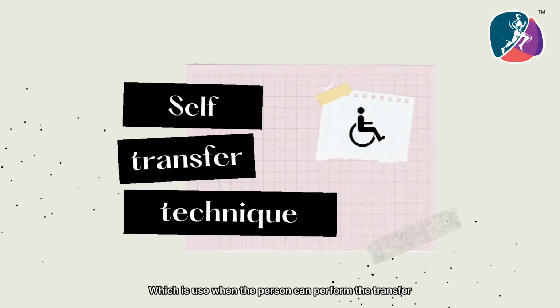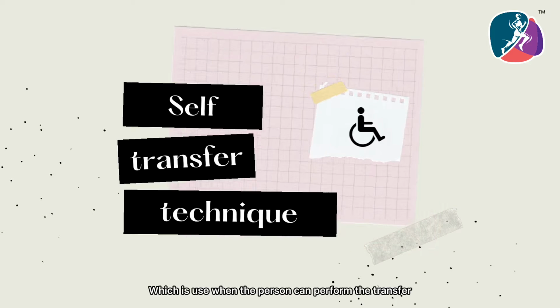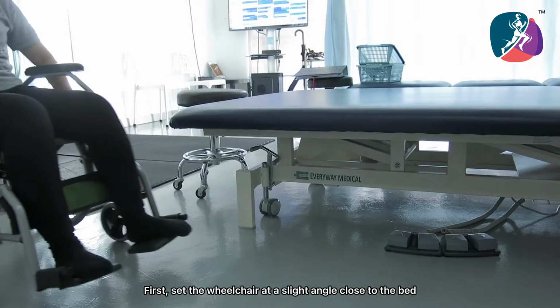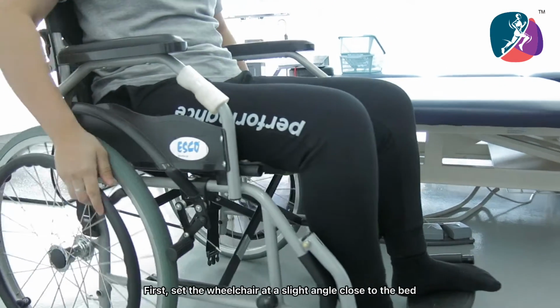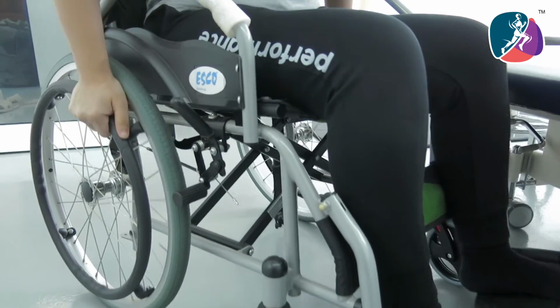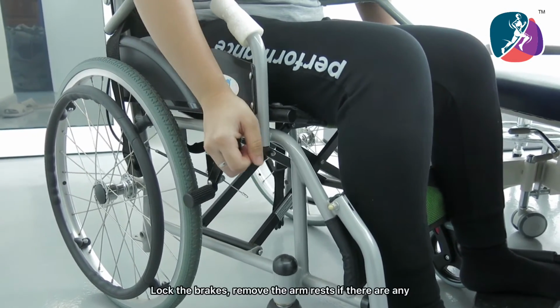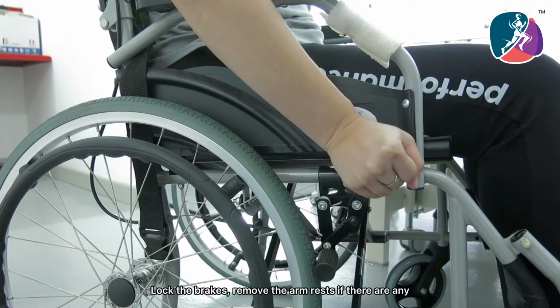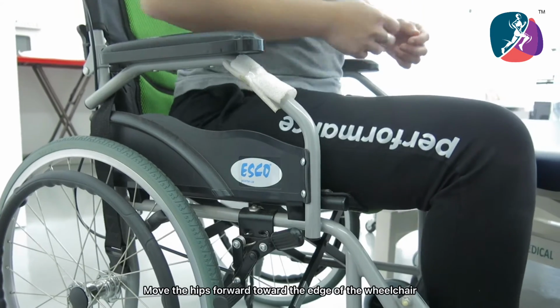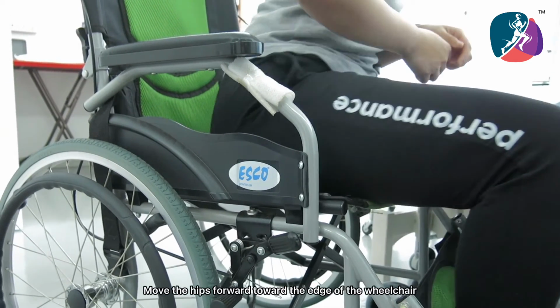Self-transfer technique, which is used when the person can perform the transfer safely without any assistance. Pop-over transfer. First, set the wheelchair at a slight angle close to the bed. Lock the brake. Remove the armrest if there are any. Move the hips forward towards the edge of the wheelchair.